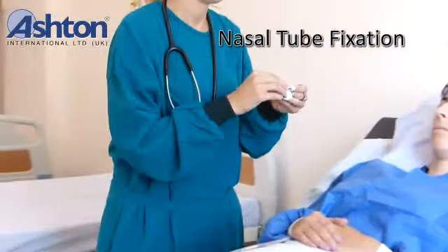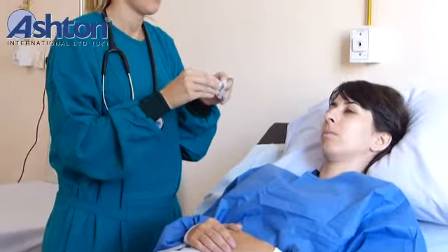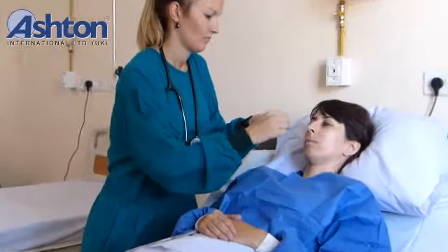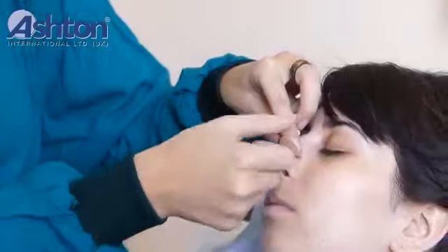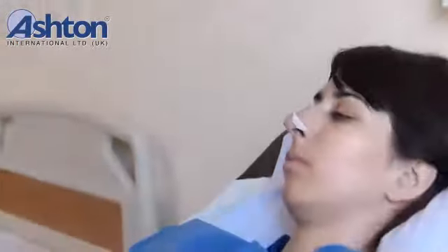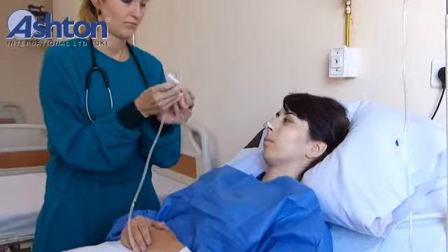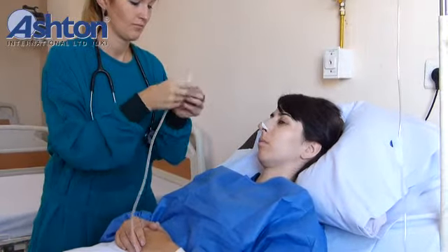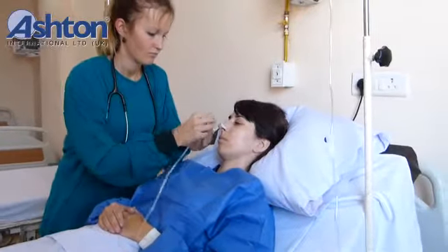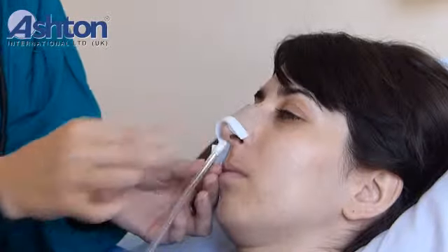Nasal tube fixation. Peel off the device from the liner. And simply fix it with convenience.